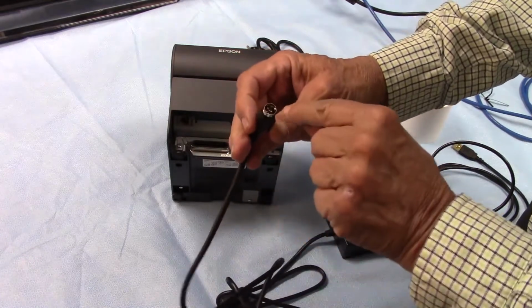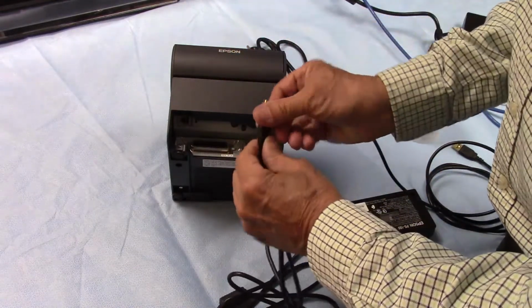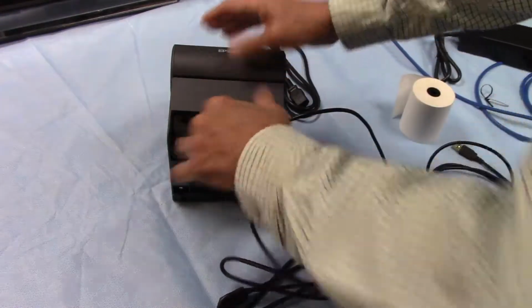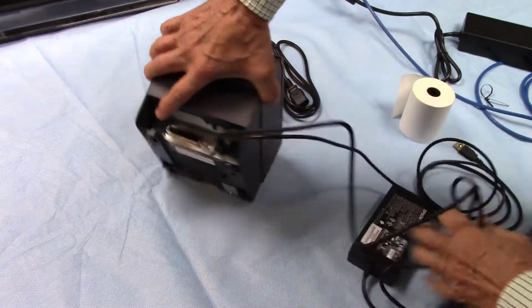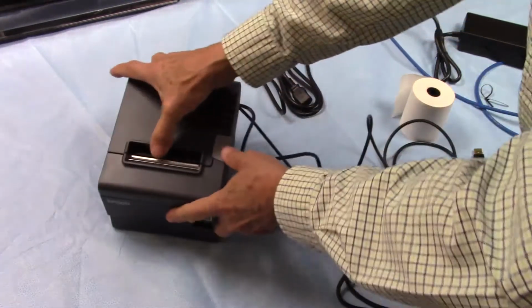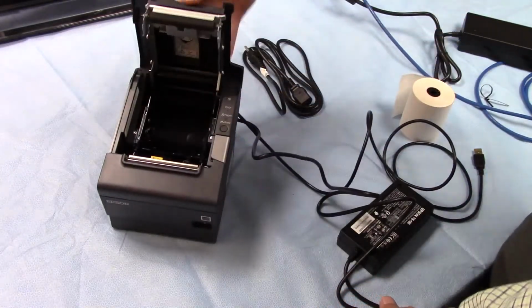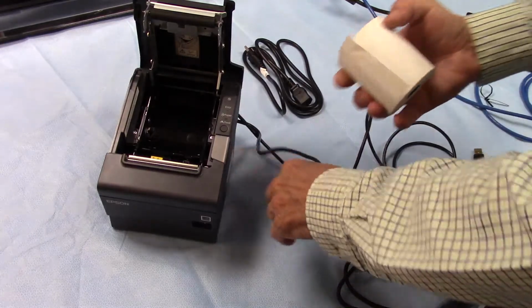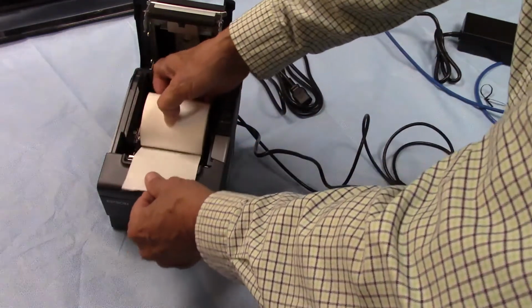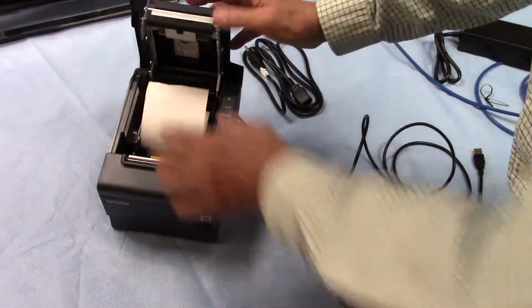This also has a key in it, and there's a notch in the receptacle. It's important to get them lined up, and it goes in. The last part of setting up the printer is loading the paper. In this case, the gray button opens it. We're going to put the paper in this orientation. A key is that it's all the way down.